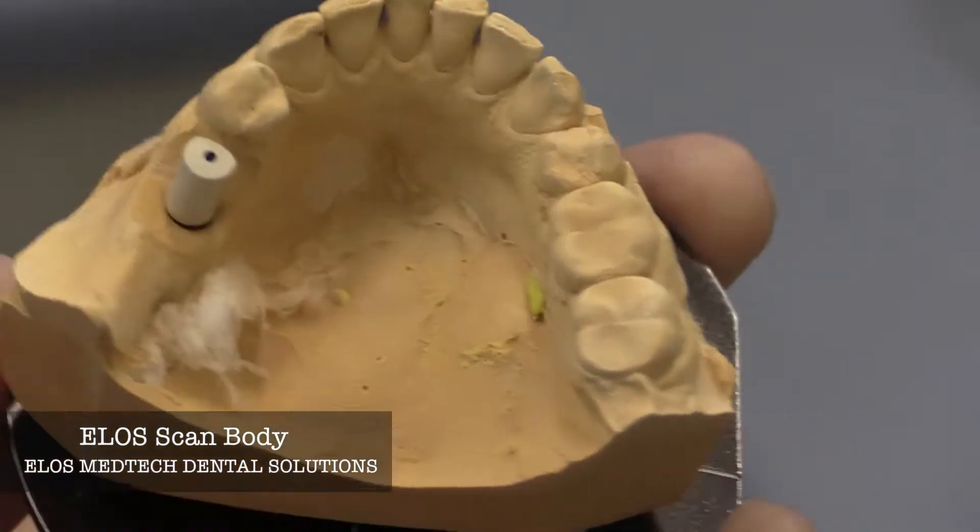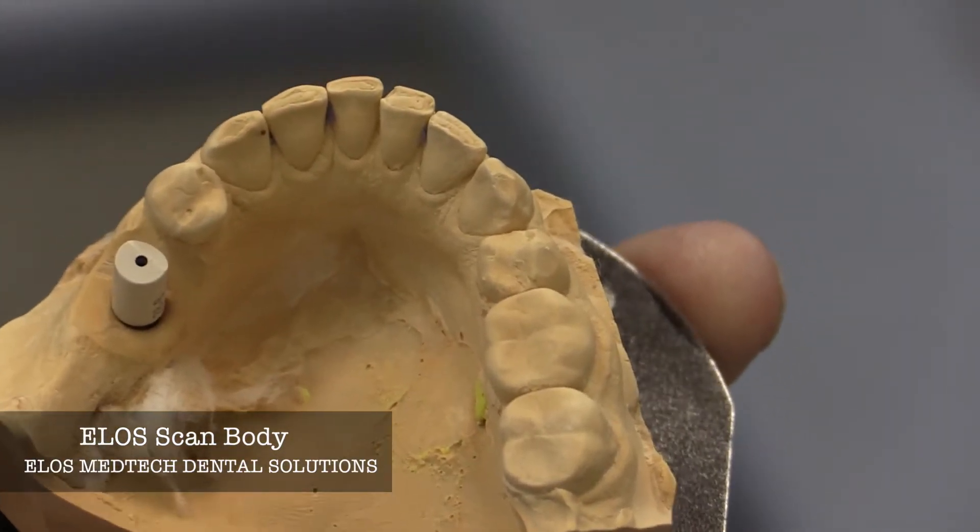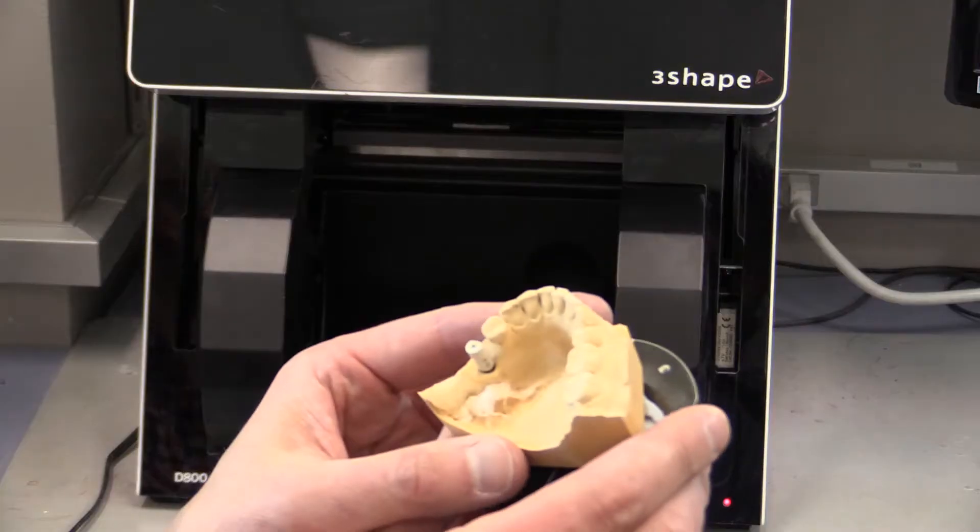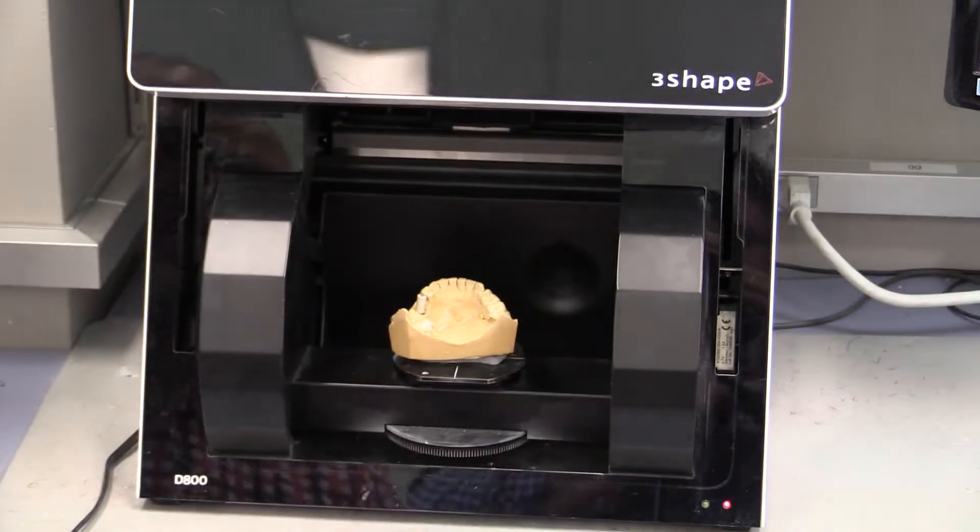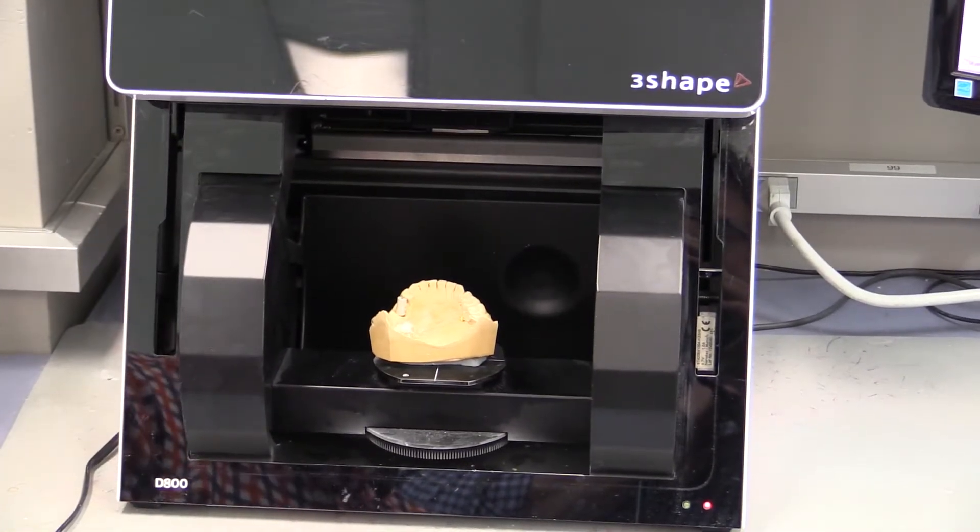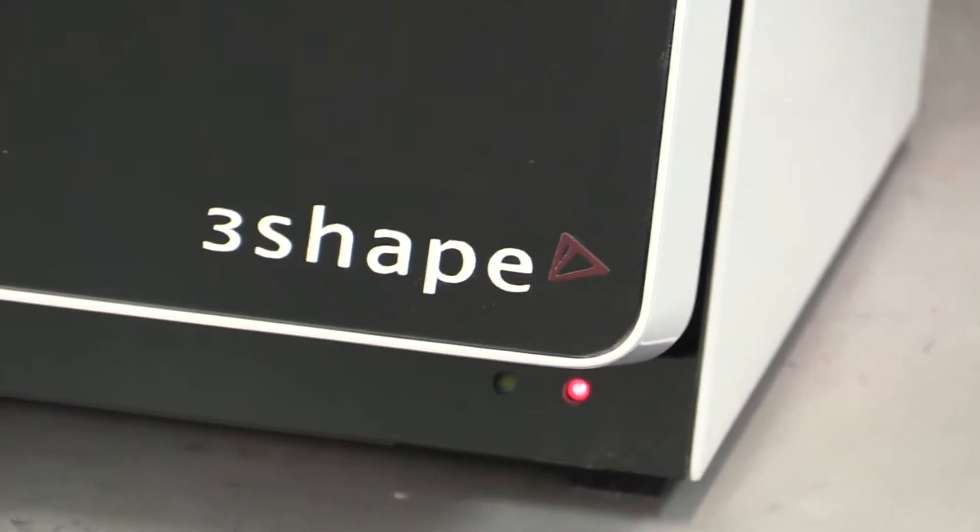And you'll see that we're able to put an ELO scan body on this analog model and then digitize this. So by putting it in the three-shape desktop scanner, the lab can then take this and create a file. It's going to be used to fabricate a crown.